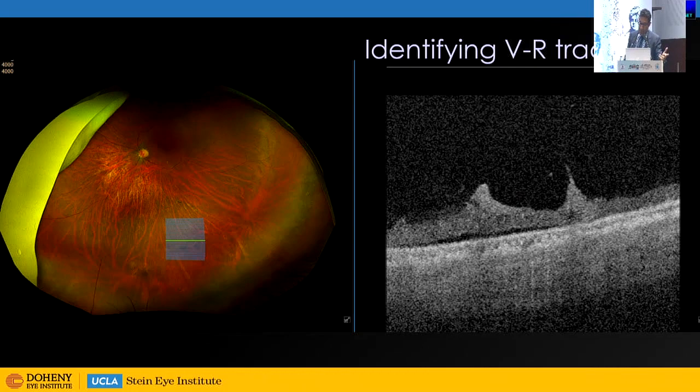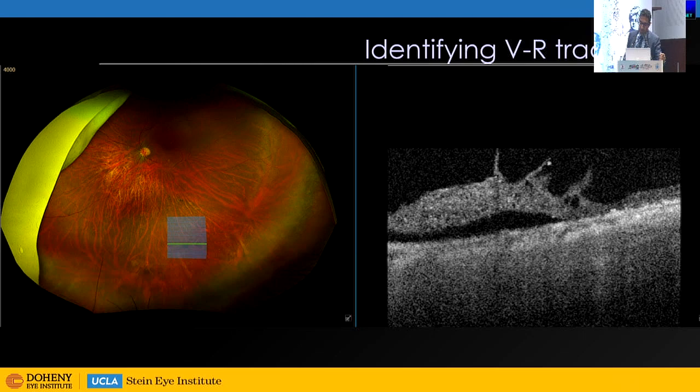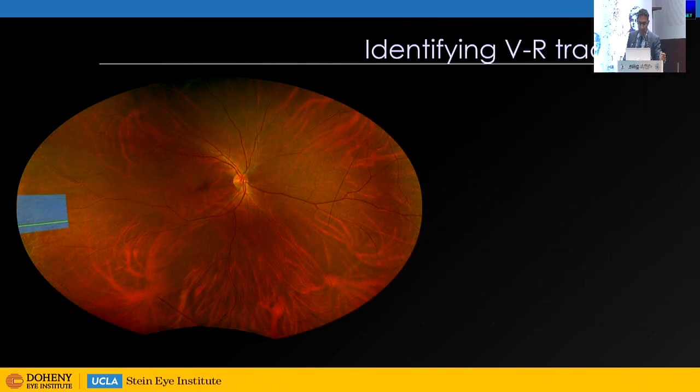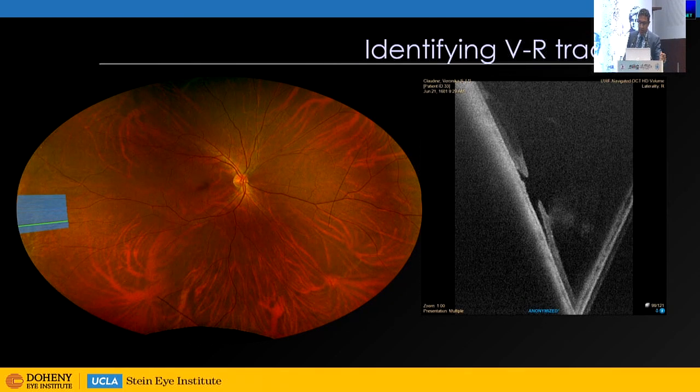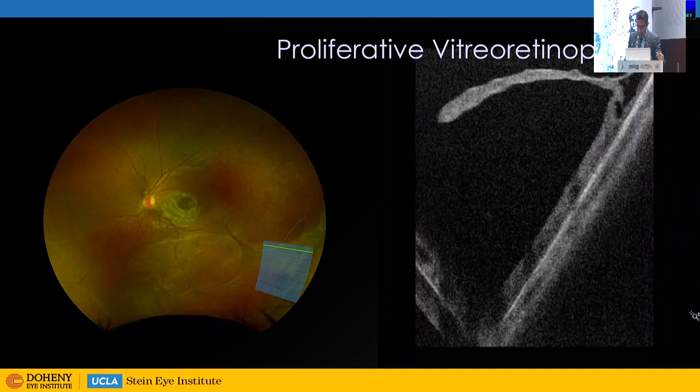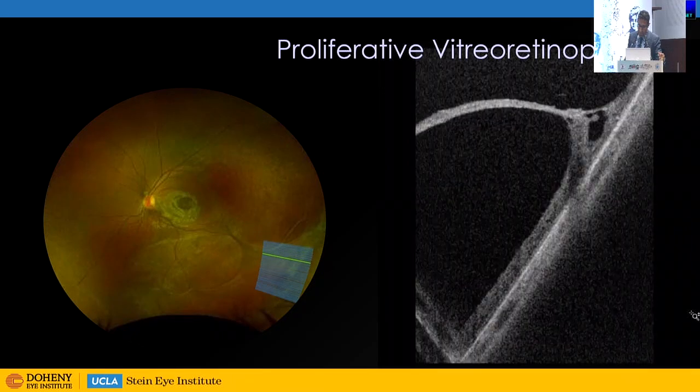Here's a patient who doesn't actually have a break, but had areas of tractional elevation in the periphery. We scanned through this densely, and we could not actually find a hole. So many examples of that. I can go on and on. A lot of patients with operculated holes still have traction. There are patients with operculated holes who don't have traction. I think those patients probably need to be treated differentially, but that'll have to be established with proper prospective studies coming up.